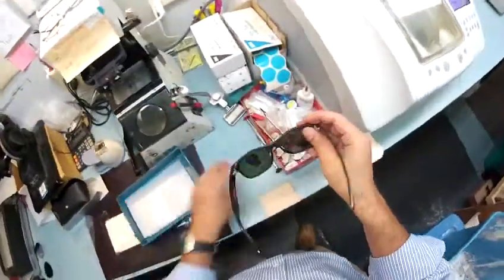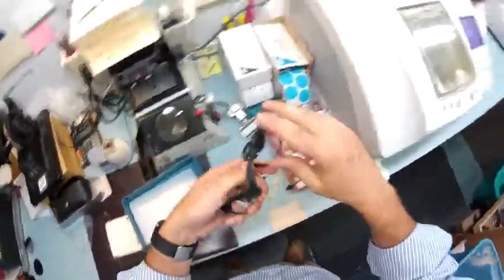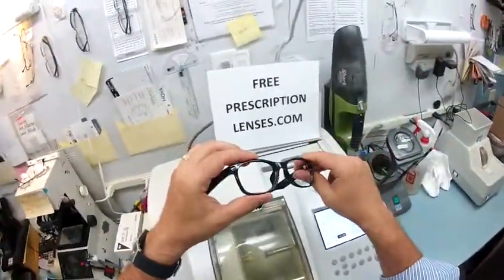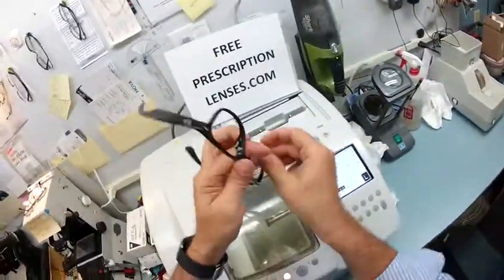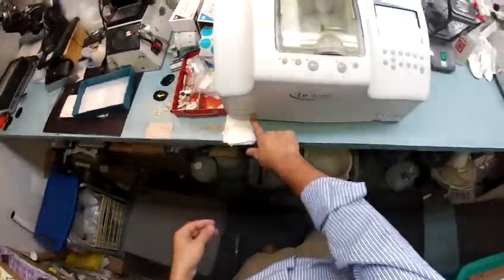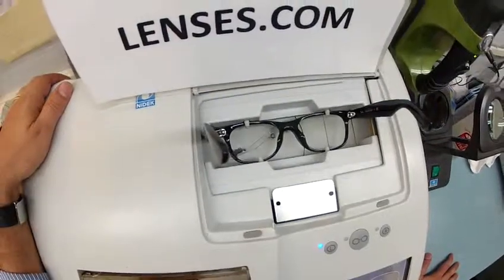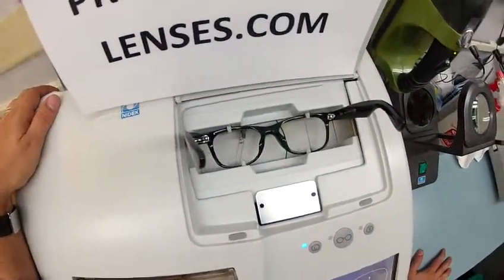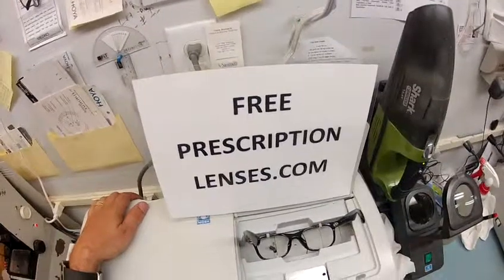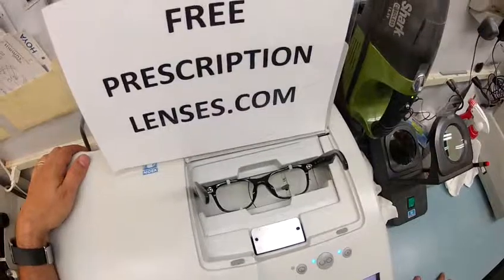I'm going to take all that off now and begin. I'm going to pop your original heavy glass lenses out of your frame. The weight of your frame is now half to a third of what it was just a moment ago. I'm just going to clean out any debris and I'm going to put your Italian frame into my Italian Santanelli — it is the LE 1000 patternless edger. The stylus has just popped up and it's going to trace the shape of your left lens and then move over and trace the shape of your right lens.